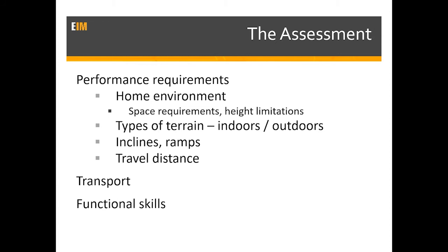Is it doable now? Is it doable 5 years from now? Is it doable all day? Okay. If they travel in the wheelchair itself, where are those tie downs? Is it crash tested? Is it easy to tie down the chair into the various different transportation things that the kiddo might use in terms of the bus going to school, going to friend's house, or the family van?